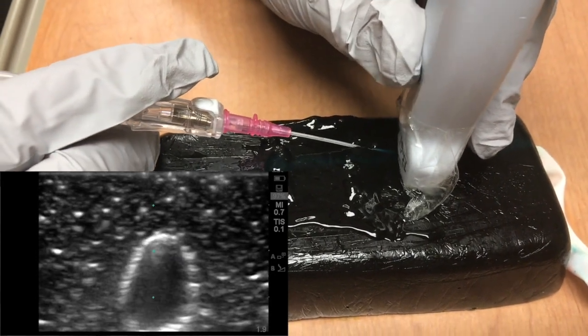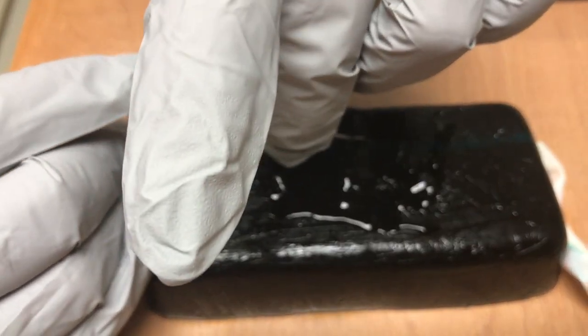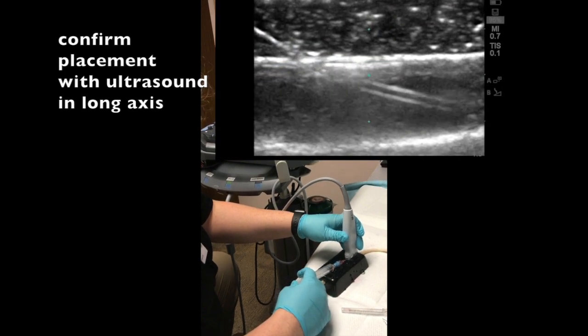A key tip to success with this procedure is that as you enter the vein you must both lower the angle of the needle so it is flat against the skin and advance at least 2-3 mm further, as the needle is longer than the catheter. Final pro tip: you can always confirm placement by placing the probe longitudinally above the vein and injecting saline. Watch as the fluid goes through the vein.